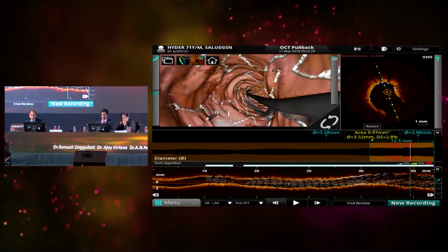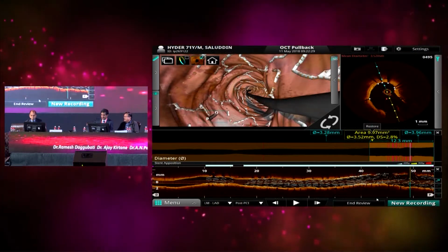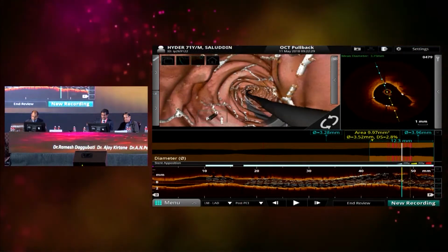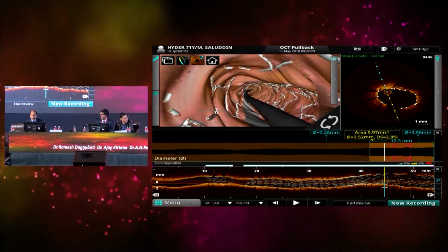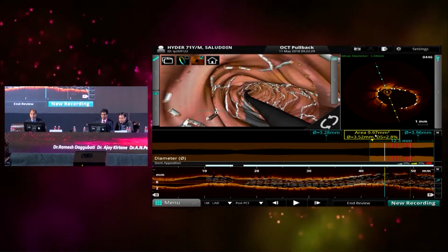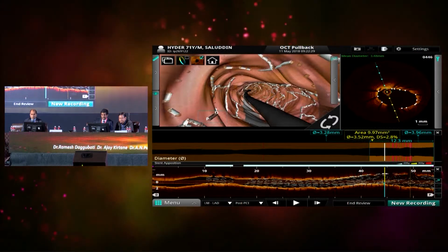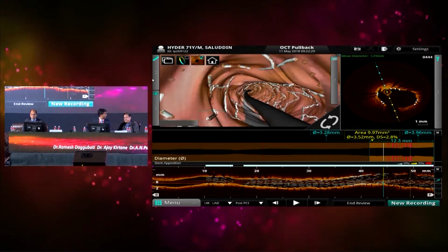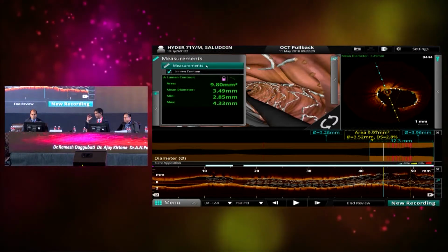What were your MSAs or your minimal lumen areas within the stent in the proximal LAD? Proximal LAD, how much is the luminal area? It's around 3.28. What about the areas? If you go a little distal to that point. Area is 9, that's the distal left main. You want the proximal LAD, is it? Yeah, it looks good though, I have to say. How much is the area? That is left main. Ostial LAD, almost the same.